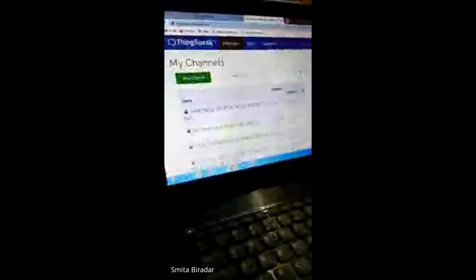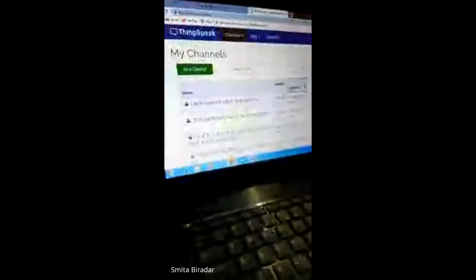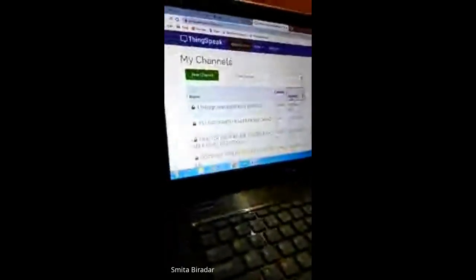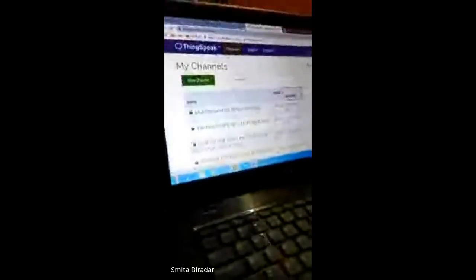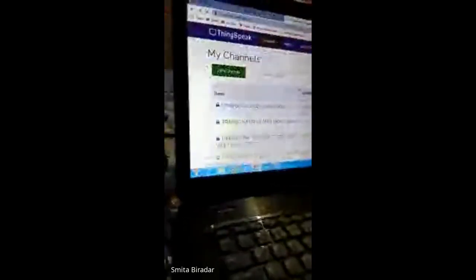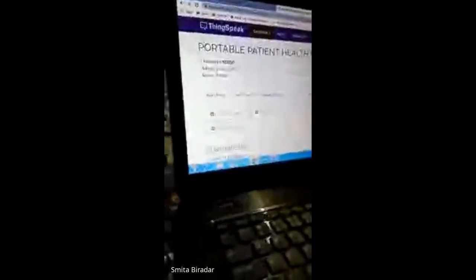I'm updating my old data. I have been checking frequently for this demo. Whatever I checked, that was 29 degrees Celsius. So again I'm updating that information on my IoT cloud. Whatever information I'm sending goes to the cloud, and again it comes back and is saved here. It will show about a minute ago. I checked my temperature about a minute ago, and it is already uploaded here.